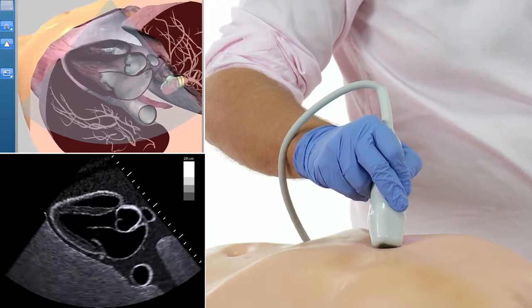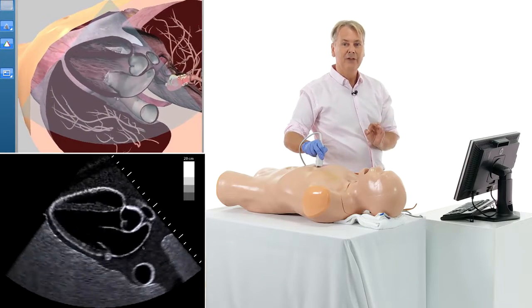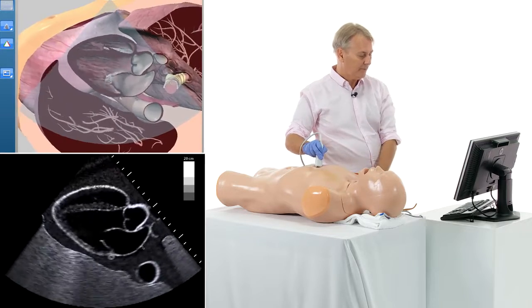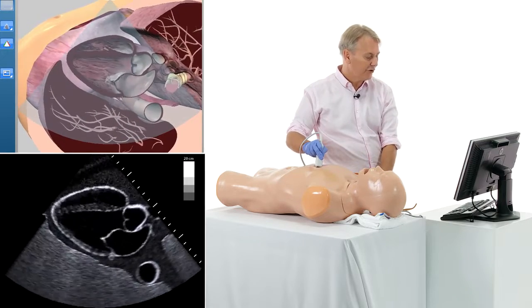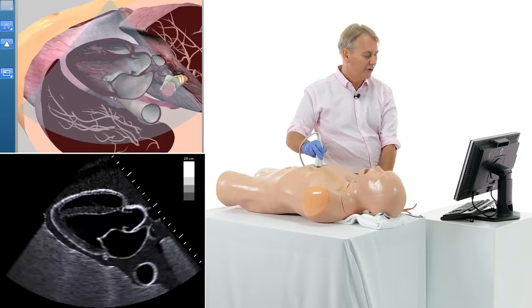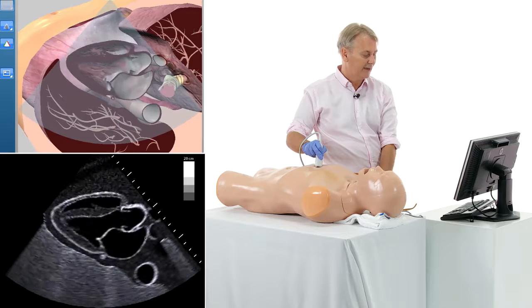So you will not be able to see these structures all the time, but if they are dilated or if you have flow there, then you know exactly which structure you're looking at. An additional important structure is the pulmonary artery, which you will see very cranial here, close to the ascending aorta, and also on top of basically the left atrium.